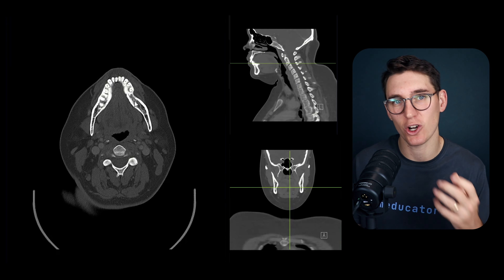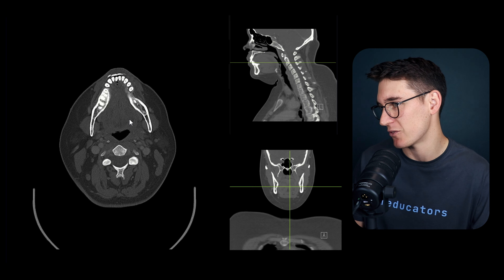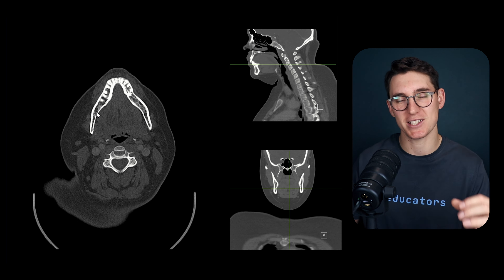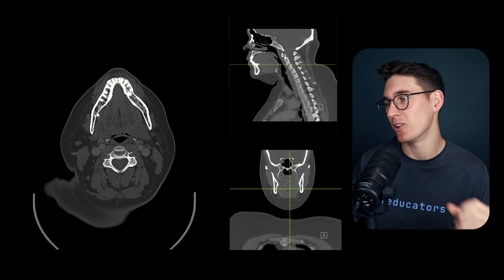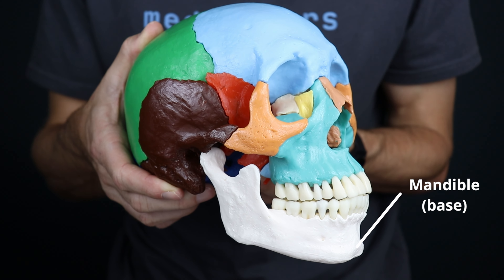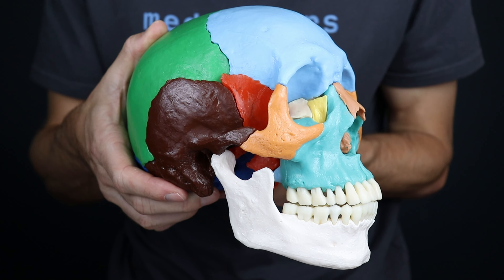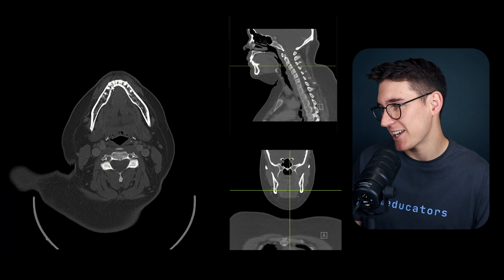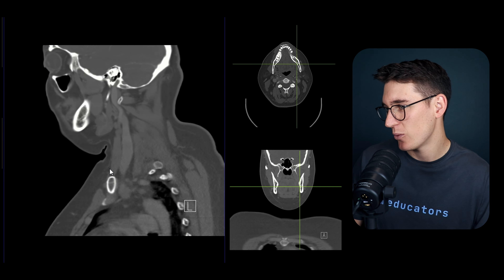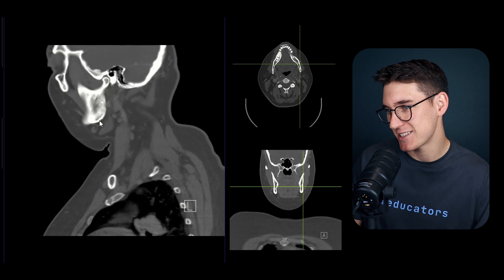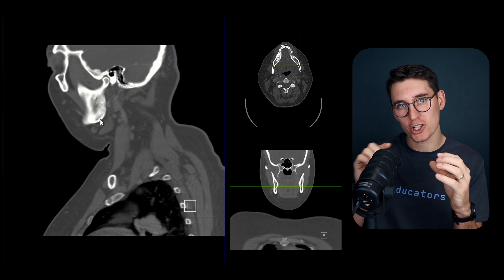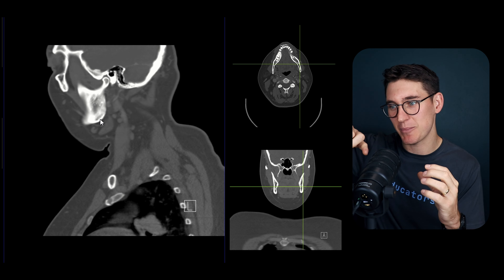The mandible can be separated into multiple parts. The body of the mandible is the anterior part, which can be divided into a bony part and an alveolar part - the alveolar part housing the teeth, and the bony part below (also known as the base of the body). Heading posteriorly, we reach an angle best seen on our sagittal slice - the angle of the mandible - which marks where the body becomes the mandibular ramus.